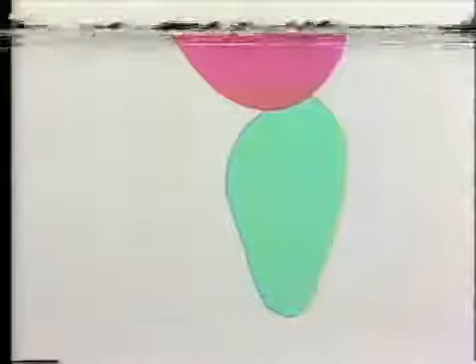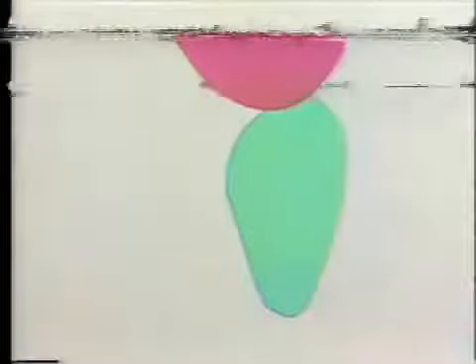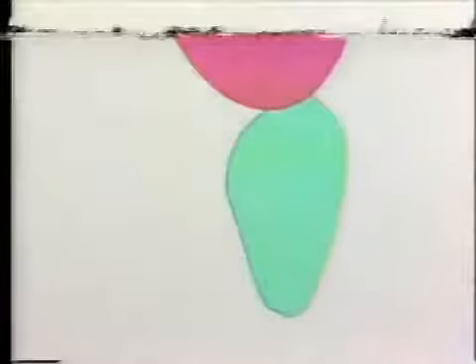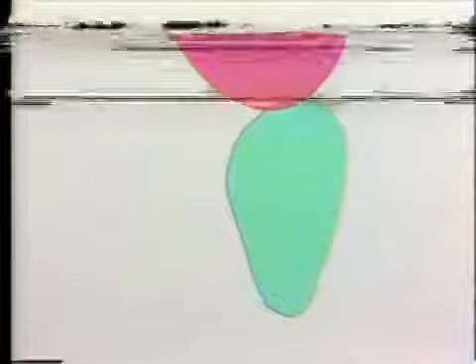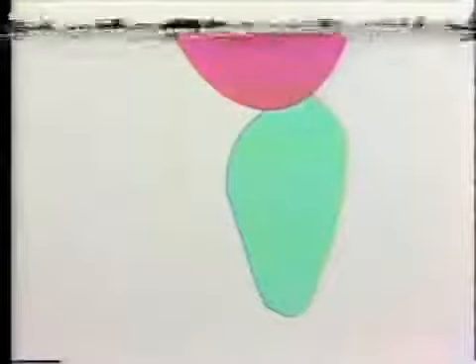So the labial surface is modified in the cervical third by swinging that in, so that it hits the new alveolus at the same level at which the original tooth hit the original alveolus. In this way, the Pontic has the same vertical length, the same cervical-incisal length, as the natural tooth.